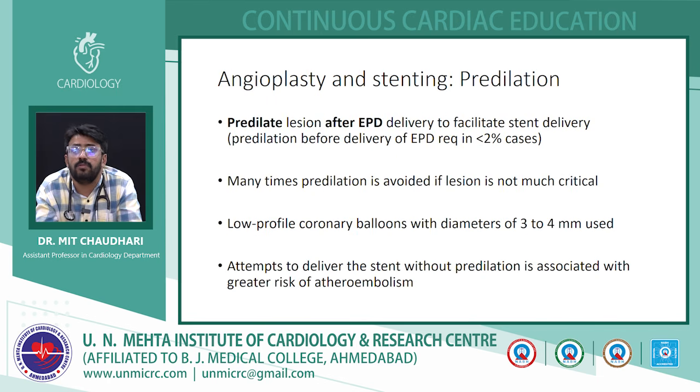So usually at our institute we do not predilate the lesion. If the lesion is very critical, which increases the risk that even our embolic protection device cannot go through it, then in such cases we predilate the lesion. Otherwise we usually avoid predilating the lesion and go directly with the stenting.